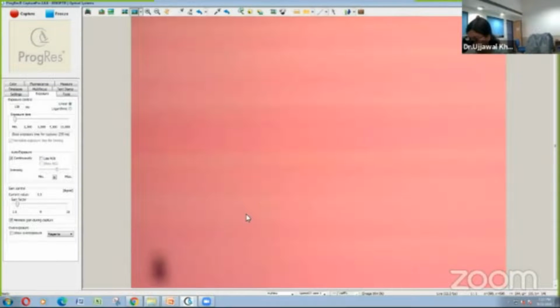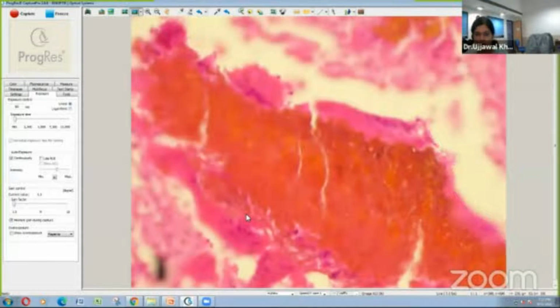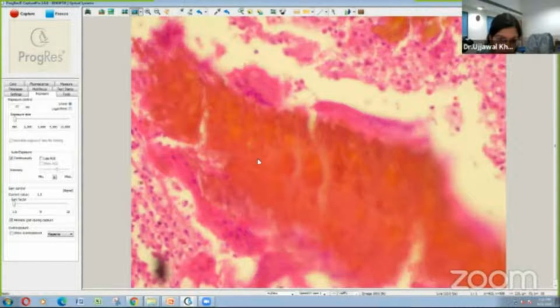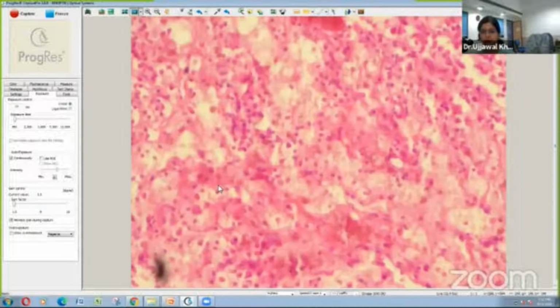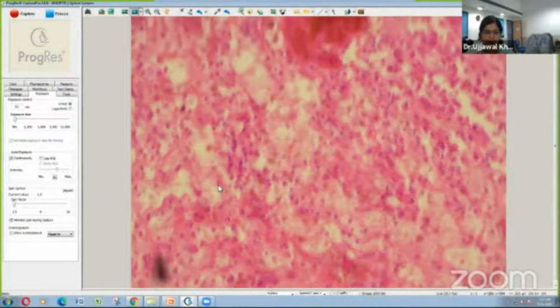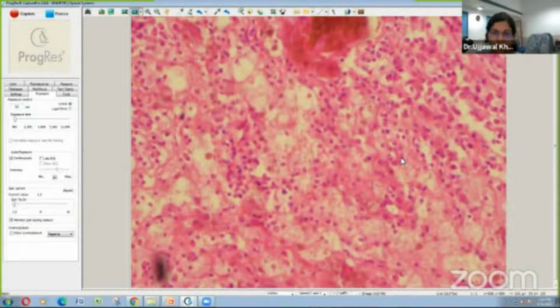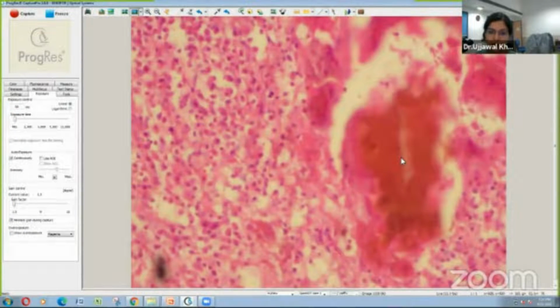This is a special stain, and we can see again here, and we can figure out some negative shadows of these. And the stain is highlighting that these grains or colonies are made up of entangled masses of septate hyphae. You can see chronic inflammation, which is more arranged at the periphery, as well as numerous giant cells.